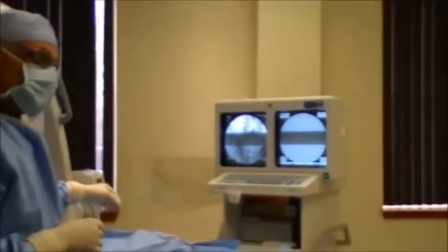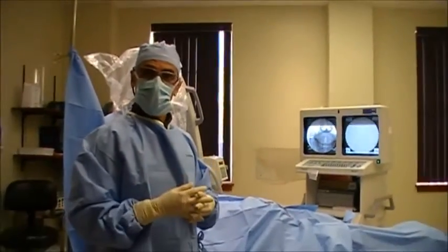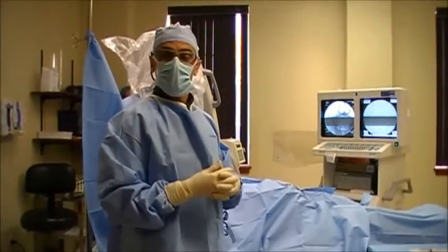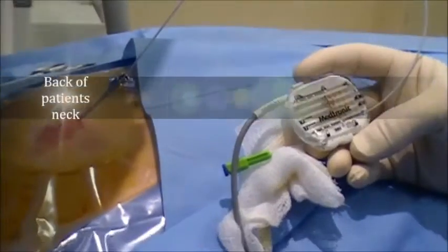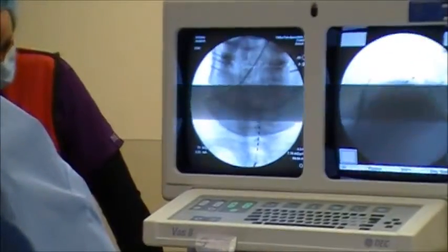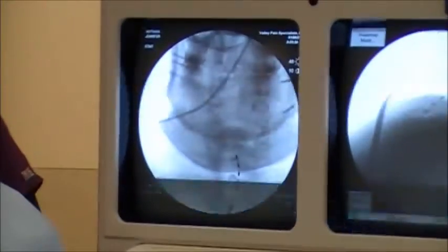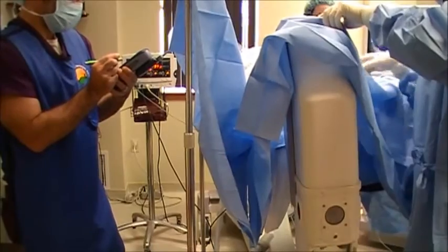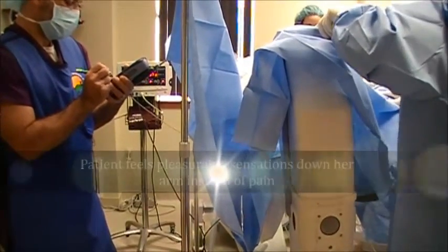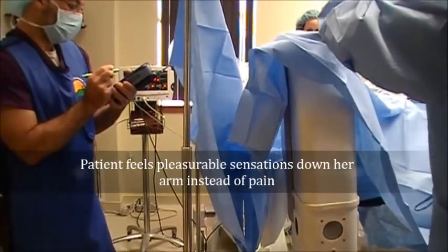We'll hook up this lead to an extension cable and hand it over to the vendor, who will then turn it on and ask the patient where they feel paresthesia — that tingling sensation we discussed. The patient reports feeling the tingling down her arm and into her fingers. That's awesome — she says it feels good.